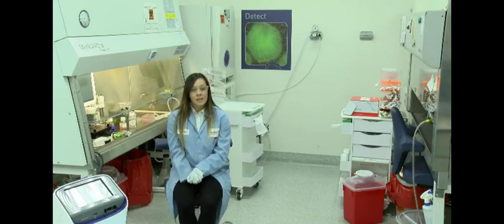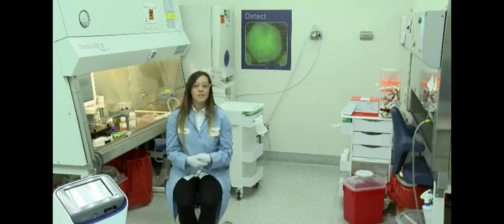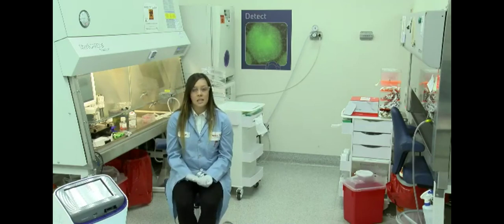And then for B27 Plus media, it's the same media formulation, but instead of Neurobasal, you're going to use Neurobasal Plus. And then instead of B27 supplement, you're going to use B27 Plus. So those are the two differences between the two medias.